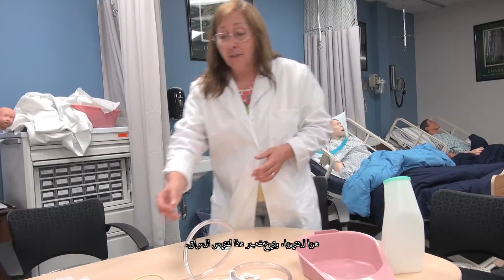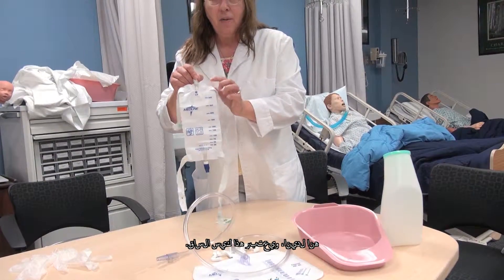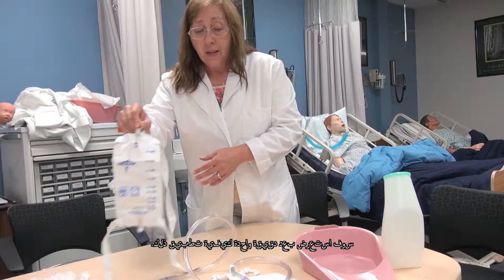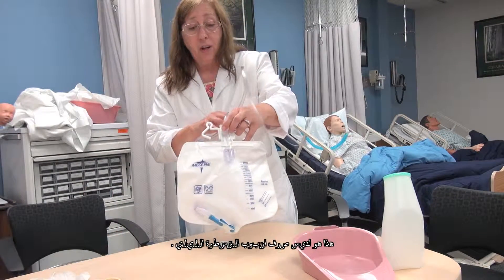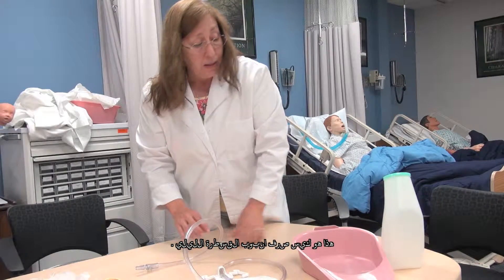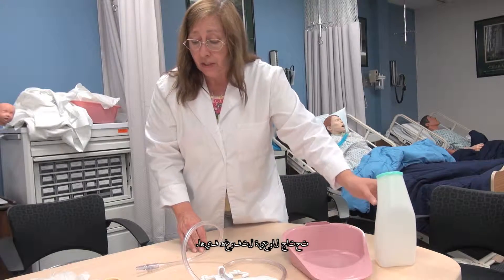Over here we have what is considered a leg bag. I will demonstrate a little bit in a minute how to apply that. This is a catheter overnight drainage bag. This is a bedpan that you can empty them into, or a urinal — you need vessels to empty them into.